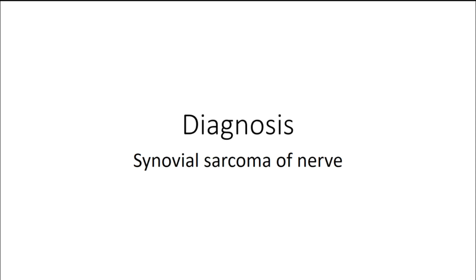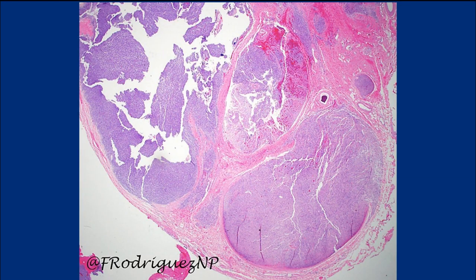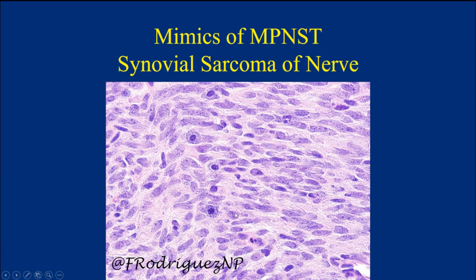So historically, you may see some papers out there stating that there are MPNSTs with the fusions of synovial sarcoma, and that is not really the current concept or understanding. You can have synovial sarcomas developing in a nerve. More commonly, you can have something like this. This is another case, and they can actually grow exactly like any MPNST grows in a nerve, infiltrating individual peripheral nerve fascicles. And again, the morphology and the immunophenotype are very similar. It's one of the main mimics of MPNST. Something to have in mind when you have a tumor in a nerve that may express some keratins or EMA or looks a little bit different. So this is another mimic to have in mind.